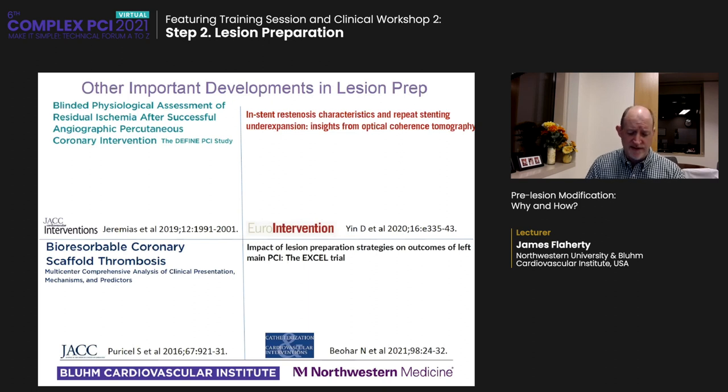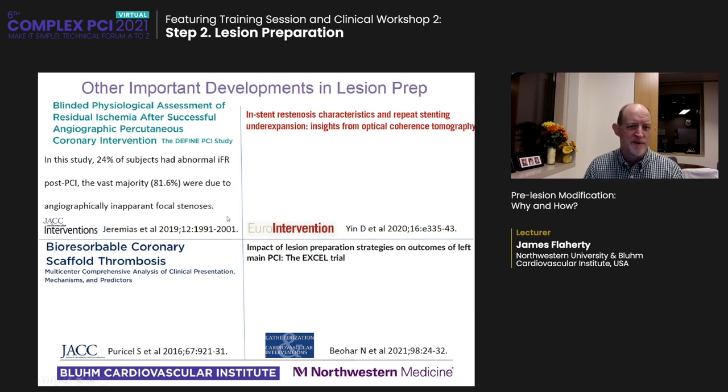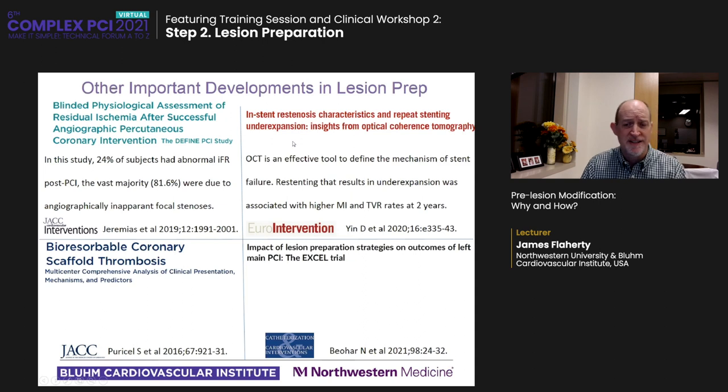Here is some other interesting evidence on the importance of lesion preparation. In the DEFINE PCI trial, 24% of subjects had abnormal iFR after PCI, and the vast majority of this was due to angiographically inapparent focal stenosis, suggesting suboptimal lesion prep. Here's a study using OCT, not just IVUS, but OCT is an excellent imaging tool. It demonstrated that stent failure and restenting with under expansion was associated with worse clinical outcomes.